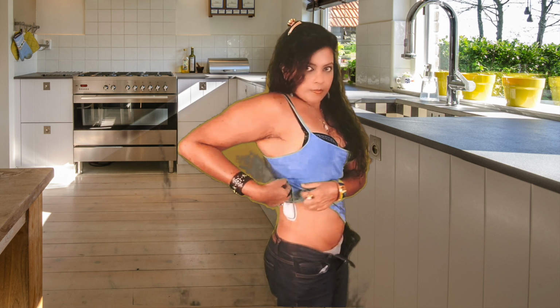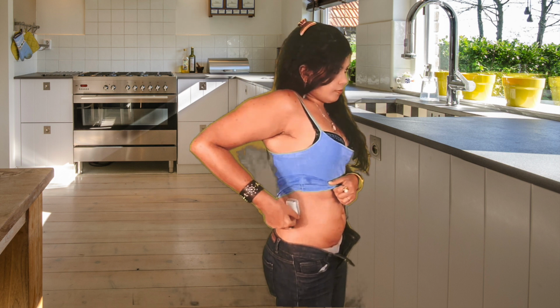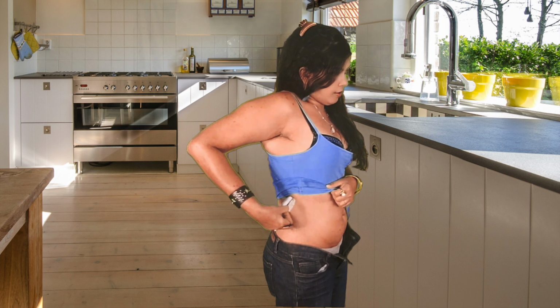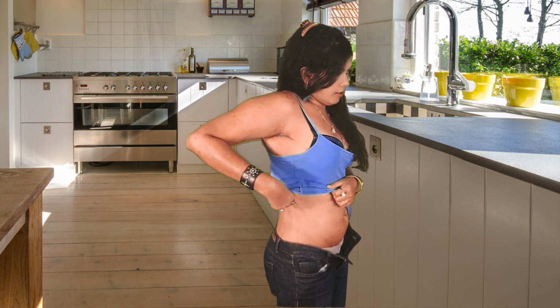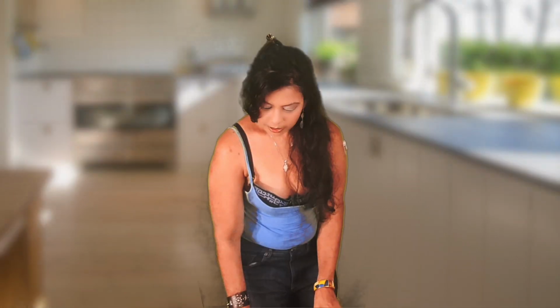Okay, I'm going to be taking off my pod first. I have deactivated it. Here's where I'm wearing it. Now that the pod is off, I'm going to set up the new pod.